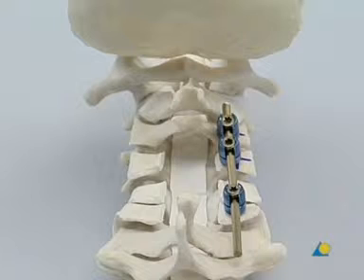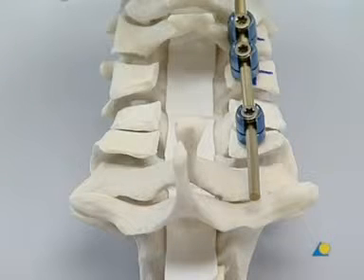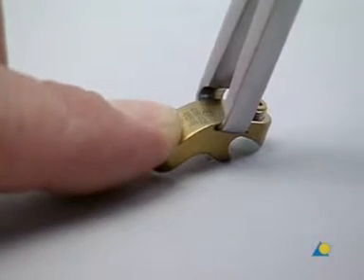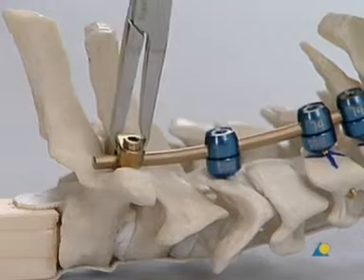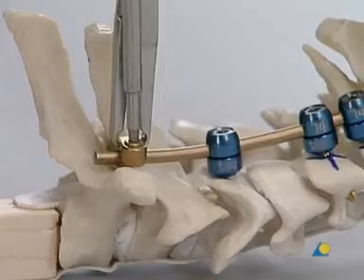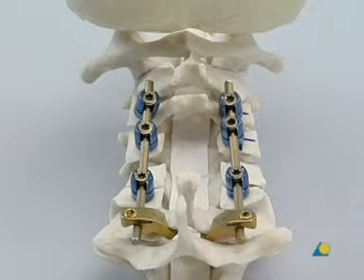This procedure is repeated for the screws at C3 and C6. The most caudal implant is now selected. In this exercise, a hook is inserted under the lamina of C7. Depending on the shape of the lamina, the lamina may have to be prepared to allow for the hook to fit properly. The hook is picked up by placing the tips of the holding forceps in the grooves of the hook. The hook is inserted under the lamina and over the rod, and tightened with the hexagonal screwdriver.